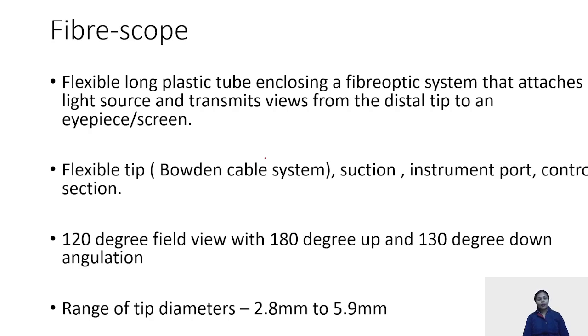Fiber scopes are a newer version used instead of laryngoscopes in order to aid in intubation in cases of anticipated difficult intubations. In anticipated difficult intubations, what we use is fiber optics, or in cases in which you have restricted mouth opening, like fracture of the mandible, panfacial traumas, or submucosal fibrosis patients. In those cases, nasal intubation can be done via your fiber scopes.